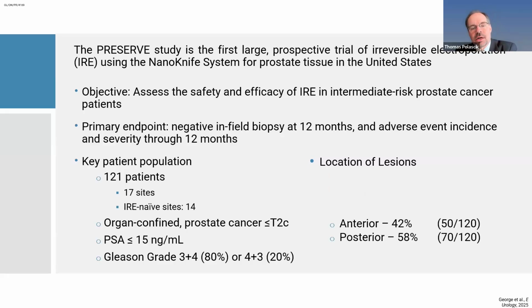Also of note, we spoke about anterior tumors and transperineal access makes it easy and facilitates electrode placement, but also 58% of the men treated had posterior tumors. So this is a very versatile instrument that can be used throughout.